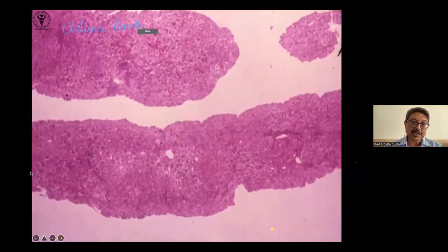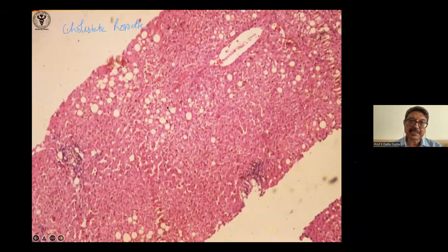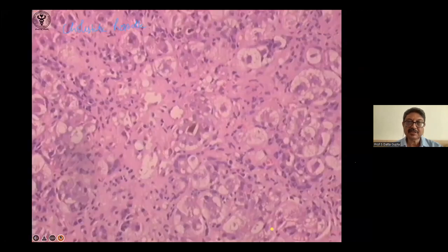Remember, in acute hepatitis, the changes are diffuse. It affects all the lobules almost equally, centrizonal more than periportal. But in this it is zone 3 more than zone 1. But in chronic, it is always patchy, and the portal areas are affected more than the centrizonal areas. So this is how you distinguish them.